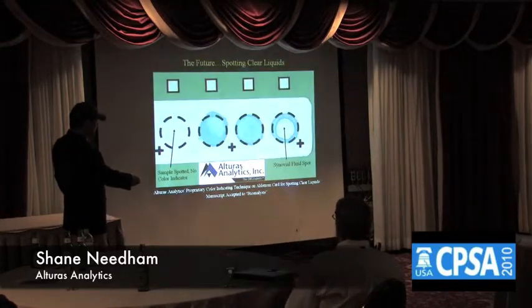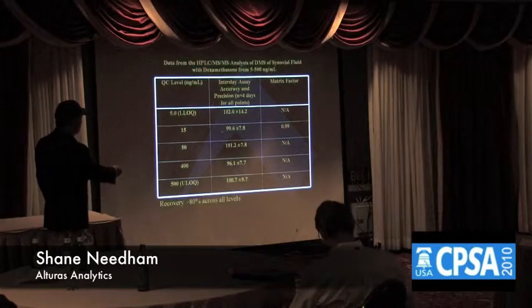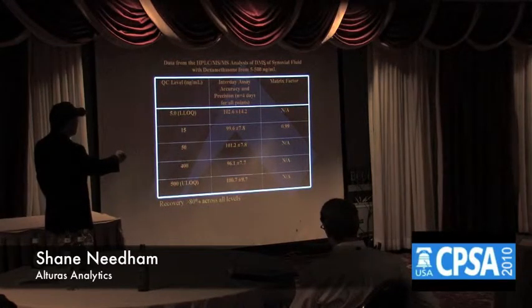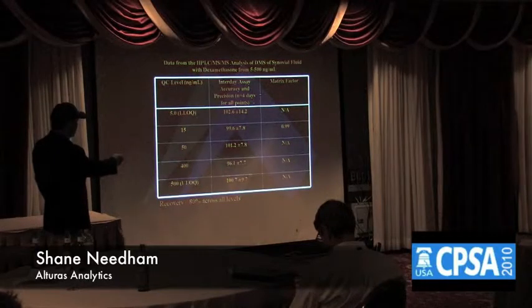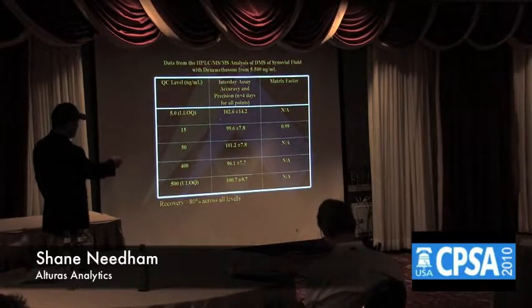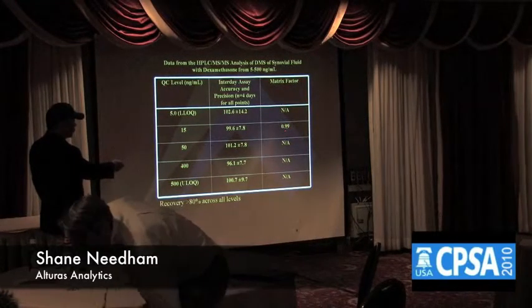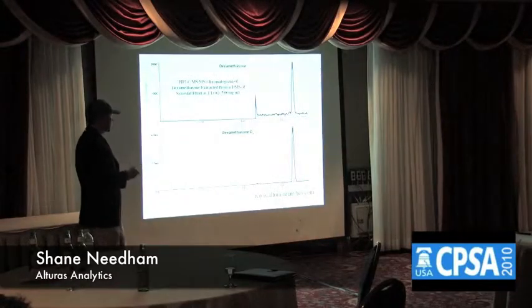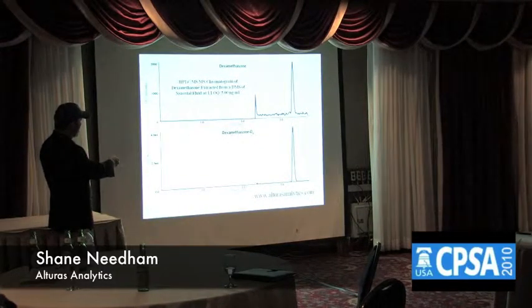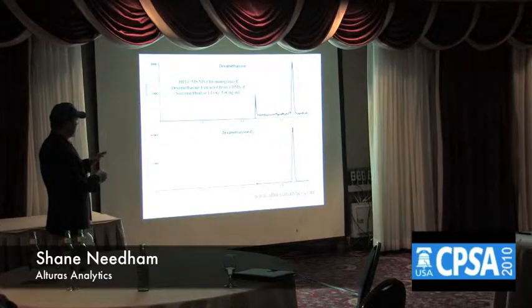A manuscript next month will be in Bioanalysis, in the issue dedicated to DBS. And this just shows our accuracy and precision, typical stuff here, right? But what we've shown here is an HPLC-MS/MS analysis of dried matrix spot of synovial fluid, 5 to 500 nanograms per mL, at all levels from the LLOQ to the ULOQ, at least n equals 4 days for all points. And we see accuracies and precision of easily plus or minus 10% all across the board. And no matrix effects. Here's the matrix factor. As this number approaches 1, we know there's no matrix effects, and great recovery as well, better than 80% across all levels. And here's just a chromatogram of a worst case scenario, LLOQ at 5 nanograms per mL. Again, accurate and precise assays, very selective, fairly sensitive, and it met the application needs for this particular application.